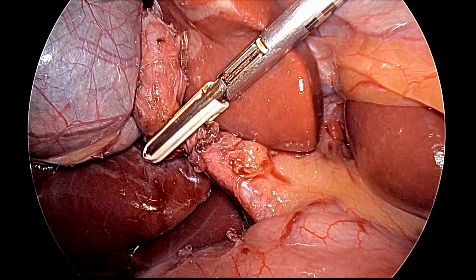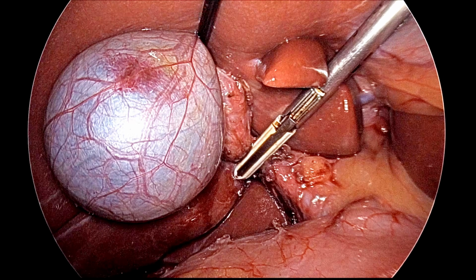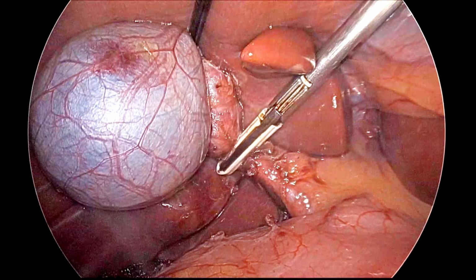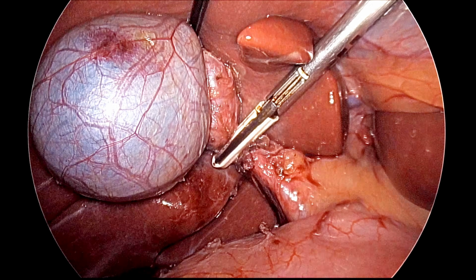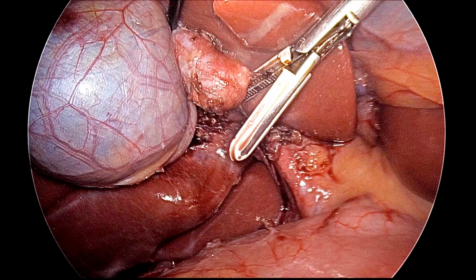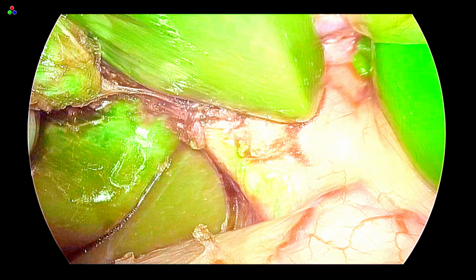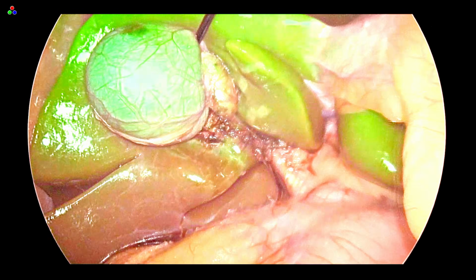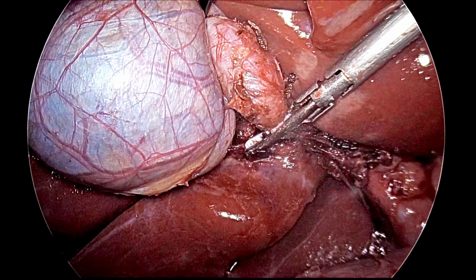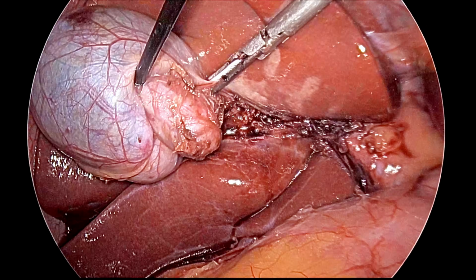This is a short cystic duct. So again, relax while sealing. It should not be under tension. So it is done. Now again ICG has confirmed that the CBD is clearly visible, the common hepatic duct is clearly visible, and now the gallbladder will be separated from the liver.